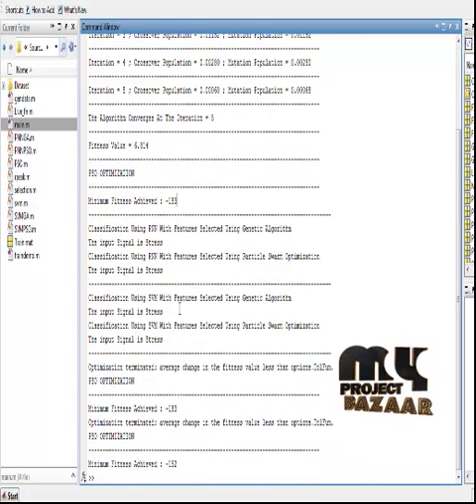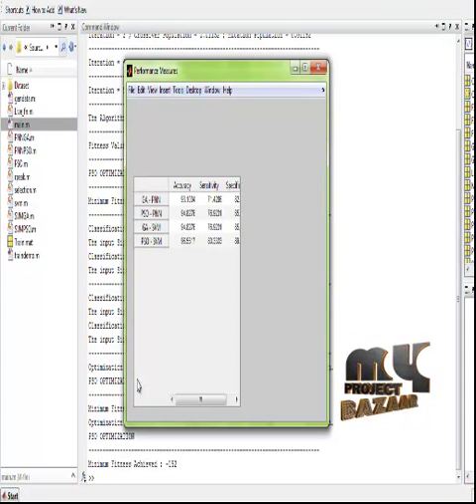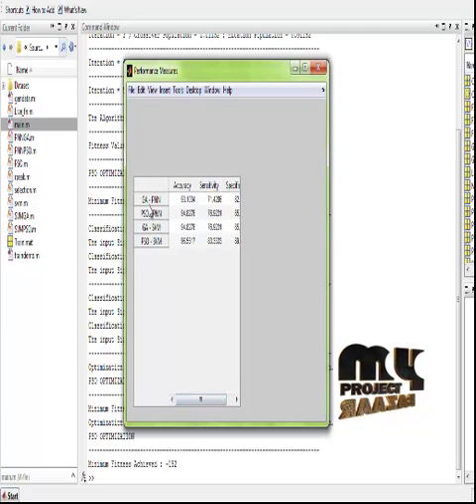And finally, this is the classification. Classification using PNN and SVM with the features selected using genetic algorithm and the particle swarm optimization is displayed here. Finally, we have measured the overall performance of the process. The performance of the process is measured with the help of the accuracy, sensitivity, and the specificity of the process calculated for each process separately. So for classification using PNN and with optimization with genetic algorithm and PSO, similarly for SVM, like that we have calculated.